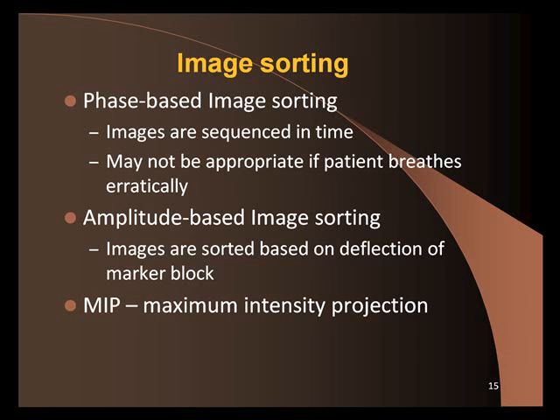So breath gating is not too commonly used, and it's used in centers. Well, first you have to have the equipment, that infrared camera, the right linear accelerator, and then you have to select your patients that breathe very evenly and are very consistent. Okay, so breath-gated radiotherapy is right now still controversial, and it's still not used across the board by everybody. But it's a modern technique, and I want you guys to know what it is because it's being used more and more these days.